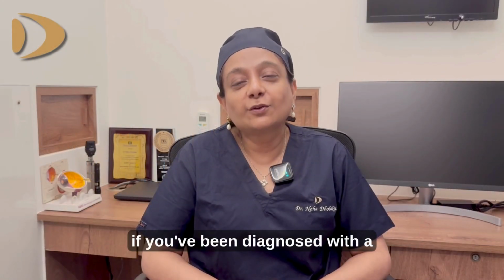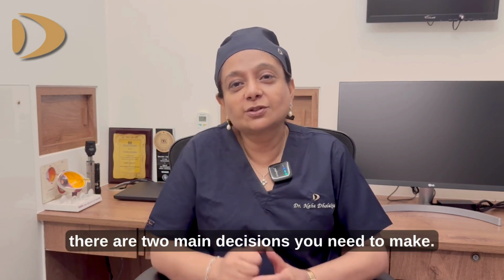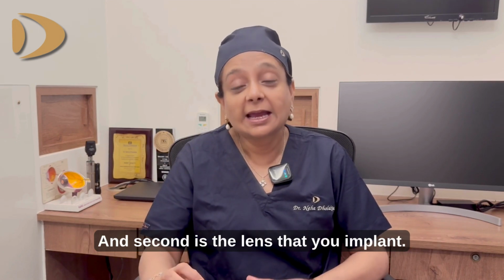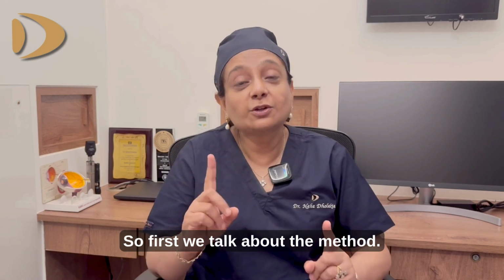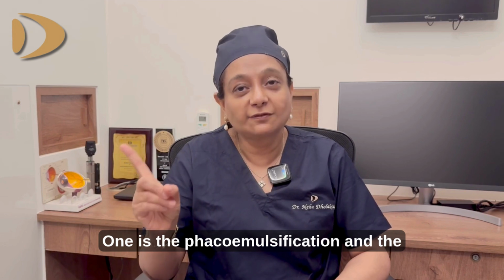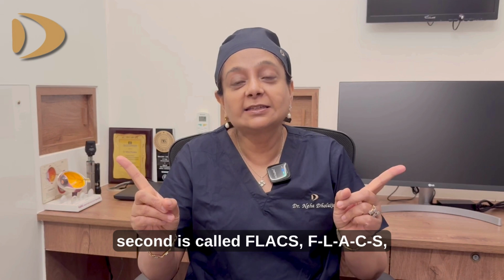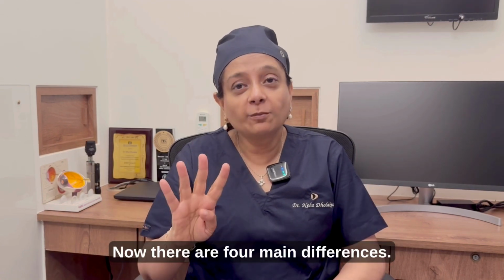If you've been diagnosed with a cataract and you need surgery, there are two main decisions you need to make. One is the method by which you do the surgery, and second is the lens that you implant. So, first we talk about the method. There are two methods. One is the phacoemulsification, and the second is called FLACS, Femto laser assisted cataract surgery. Now, there are four main differences.